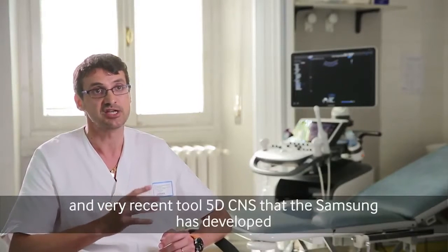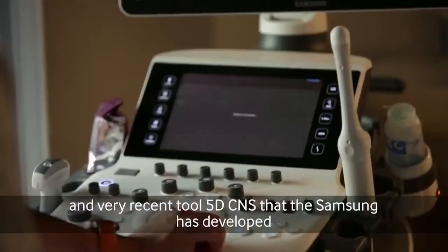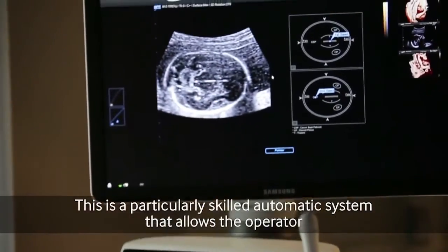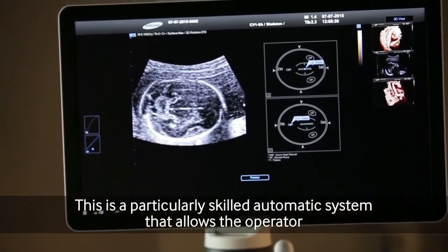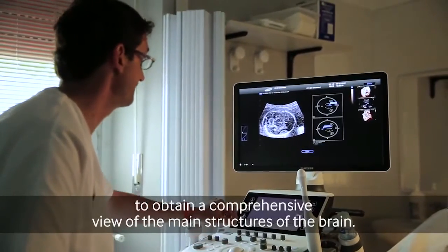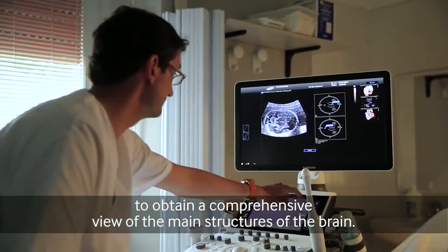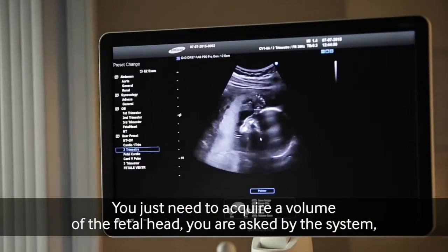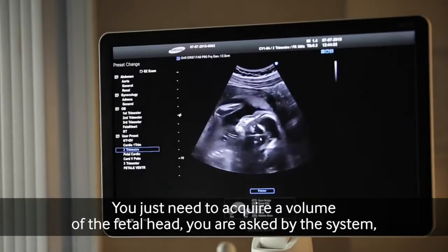At the end of the ultrasound scan, we used a particular and very recent tool that the Samsung machine has developed, which is called 5D CNS. This is a particularly skilled automatic system that allows the operator to obtain a comprehensive view of the main structures of the brain. You just need to acquire a volume of the fetal head.